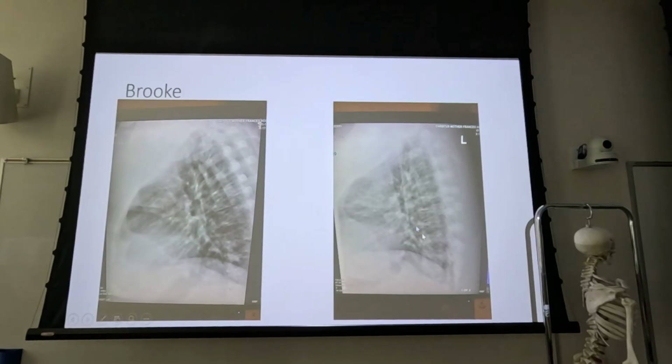So it looks to me like what they did was they shot a lateral. They said, wow, we cut off a lot. If they would have repositioned this patient perfectly, and you got rotation on this one. The first one, not much rotation, but this one's, you know, it's getting pretty bad. But if they'd have positioned this patient perfectly, would they have gotten him on the second shot? No, he's too big, right?